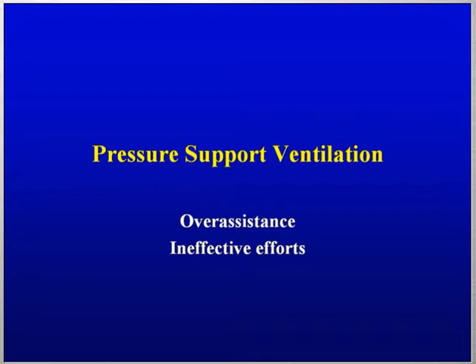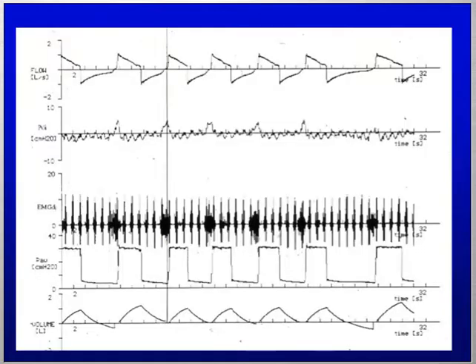We have discussed over the last years about decreasing work of breathing. Maybe for this reason, people did not pay enough attention to the fact that it's also a bad thing to decrease too much work of breathing. We need to avoid excessive level of work of breathing and oxygen cost of breathing, but we don't want patients to have almost nothing like work of breathing. And I think this is today one of probably the major problems we have in the intensive care.